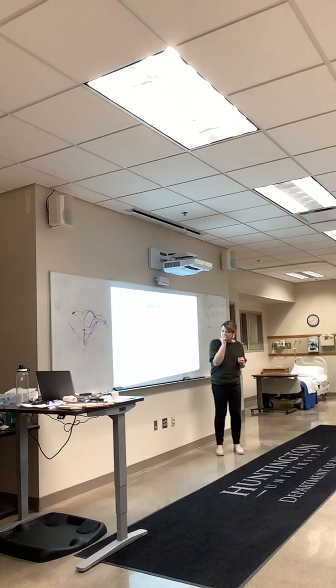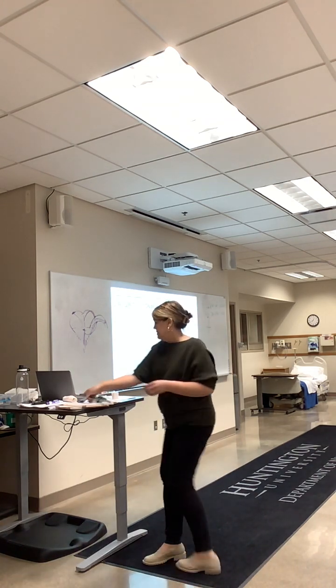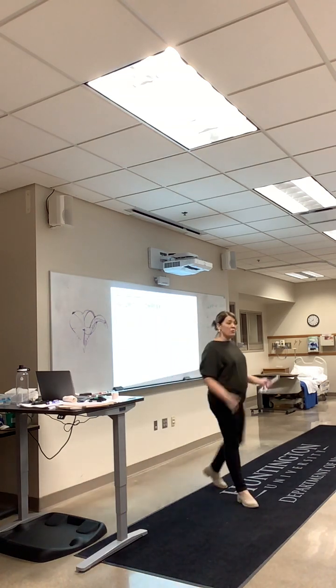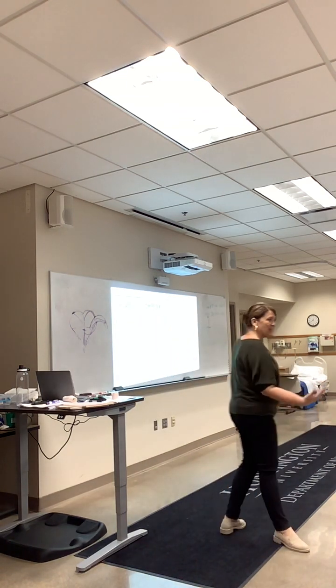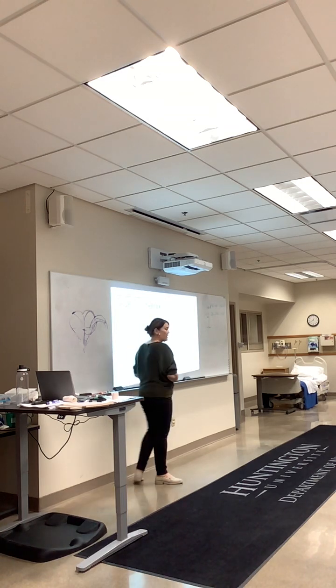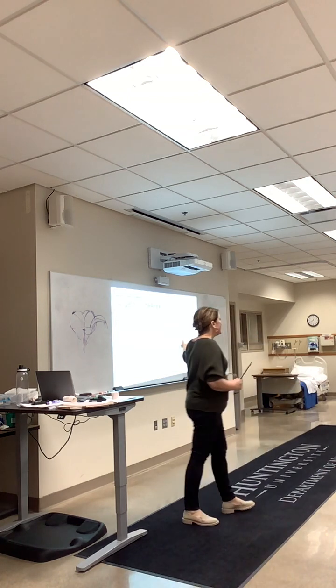So if I was taking, here's my paper, and I need to take your calipers. Here's my PR interval right here. So I'm going to start measuring it, and it is how many boxes? 1, 2, 3, 4 and a half boxes. So I know my PR interval is okay. That's basically what you do. If I have my QRS, how many boxes was that? 2 boxes. Is that okay? That's in 1.5 to 2.5 boxes, so we're good. So it's a narrow QRS.